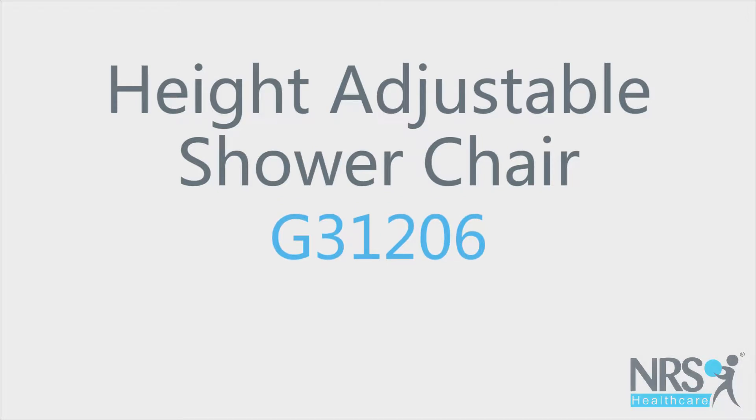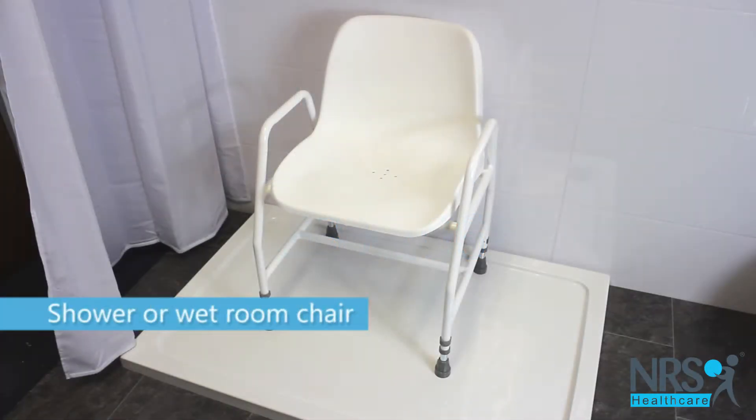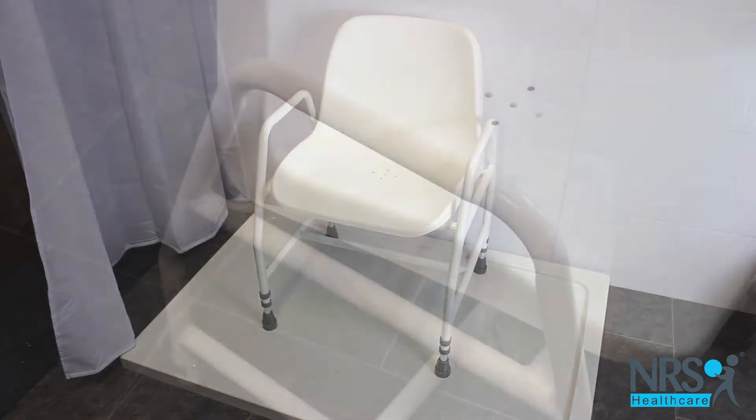Height adjustable shower chair. This chair is suitable for use in the shower or a wet room and has a comfortable moulded seat.